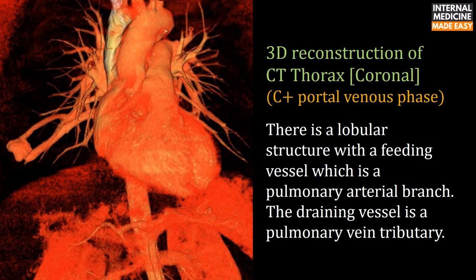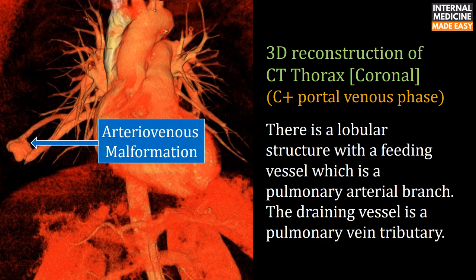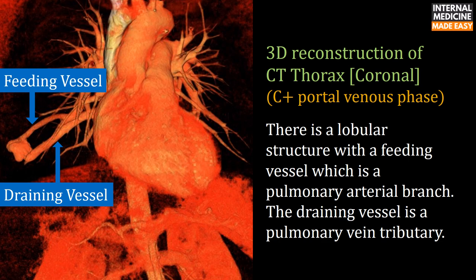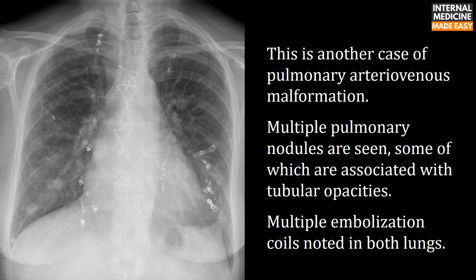This is the 3D reconstruction of contrast-enhanced CT thorax, coronal view. There is a lobular structure with a feeding vessel, which is a pulmonary arterial branch, and a draining vessel which is a pulmonary vein tributary. This is another case of pulmonary arteriovenous malformation showing multiple pulmonary nodules, some associated with tubular opacities, with multiple embolization coils noted in both lungs.